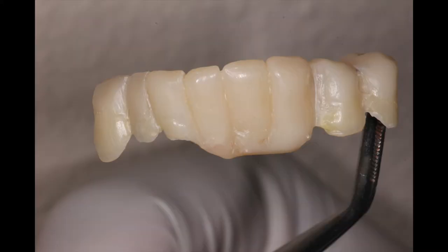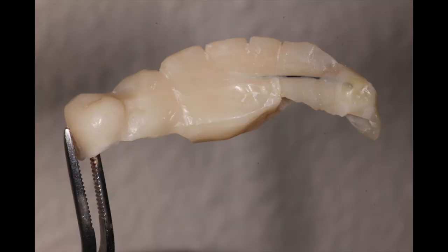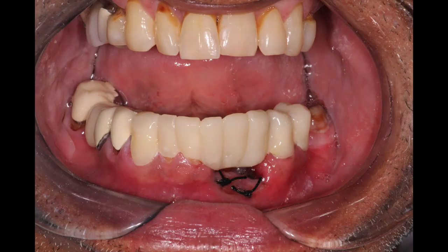After trying the temporary back and forth, getting the occlusion worked out, reestablishing some of the character to the teeth and polishing it, this is what we wound up with — and you can see it's in place. We also went with a hygienic base pontic with a space underneath it. The sockets across all three of those adjacent teeth are going to heal to a kind of flat surface. When you have three teeth in a row in the lower anterior segment, given the amount of bone loss he's already had, it's going to heal flat.